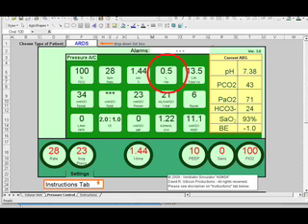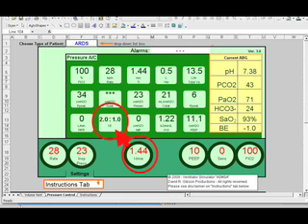Next, I turned my attention to improving oxygenation using an inverse IE ratio. After monitoring my adjustments, I determined that an inspiratory time of 1.44, I was able to achieve an IE ratio of 2 to 1 inverse.